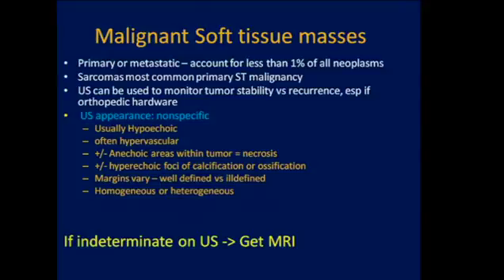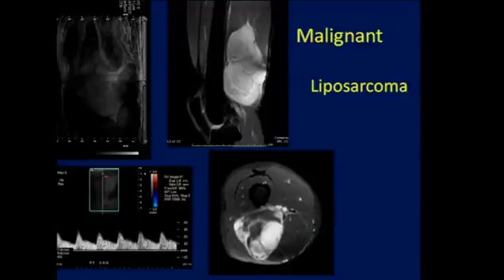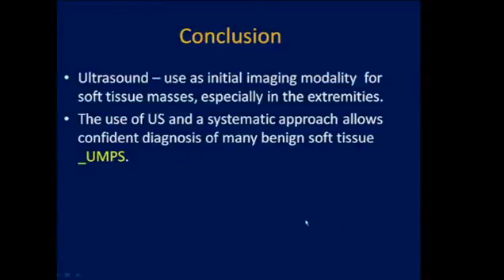So here's my recommendation. If you scan someone and you can put it into the classic, benign appearing entities that we just discussed, that's fine. But if it's indeterminate and you're not sure, then we need further evaluation. Like this patient. This patient came in with a palpable lump behind her knee. She came in to assess for a popliteal cyst, but what we saw was a large, heterogeneous soft tissue mass. There was flow on color and pulse Doppler imaging. We obtained an MRI, and what we see is this lobulated soft tissue mass with heterogeneous enhancement, and this was a malignant liposarcoma.